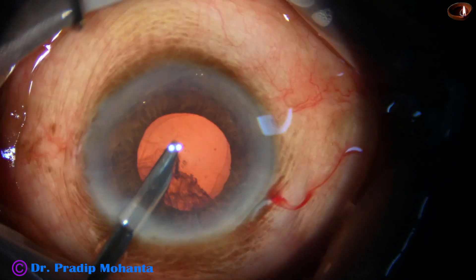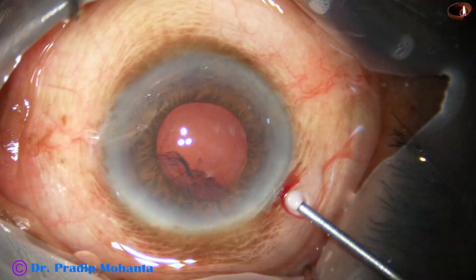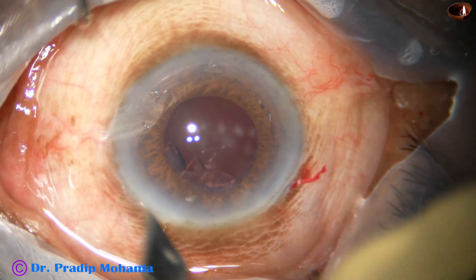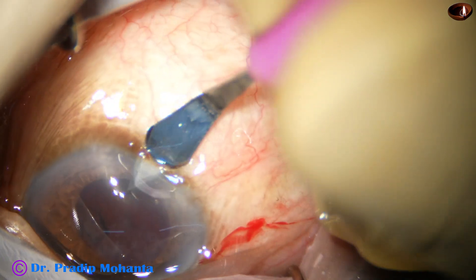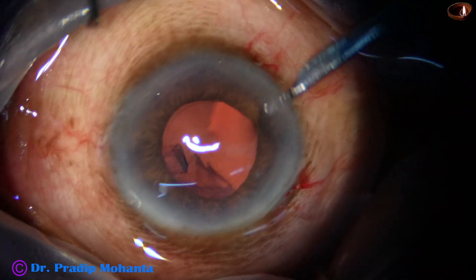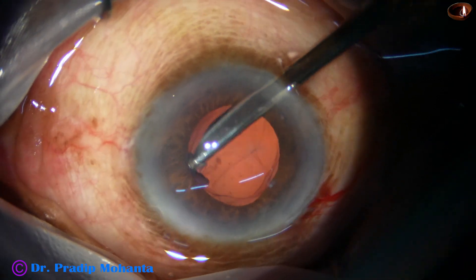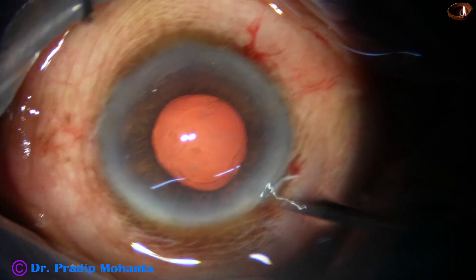I go through the side port and remove the cortex from 9 o'clock, then the cortex from 11 o'clock to 2 o'clock. I don't want to remove this from the main wound, so I am going to make another wound 90 degrees away. If the side port is 90 degrees away from the main wound, astigmatism produced by the main wound will be neutralized to some extent by the side port. And easily through this new side port, I could remove the cortex from 11 o'clock to 12 o'clock.